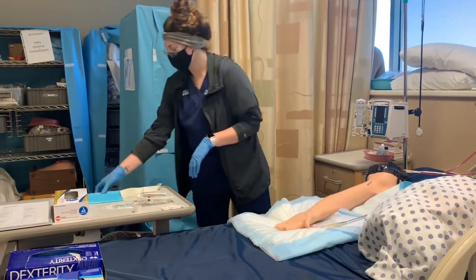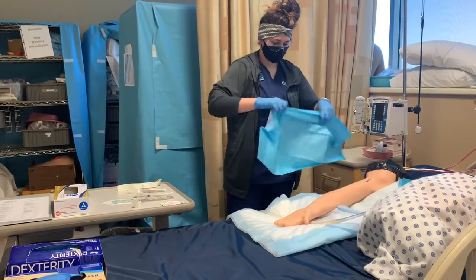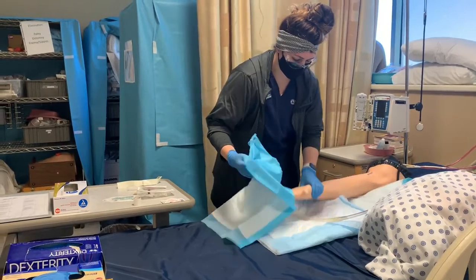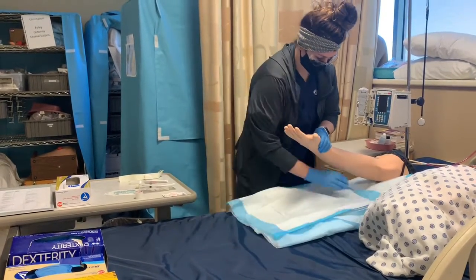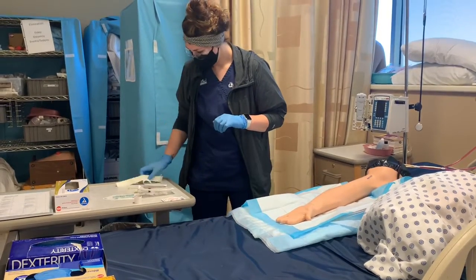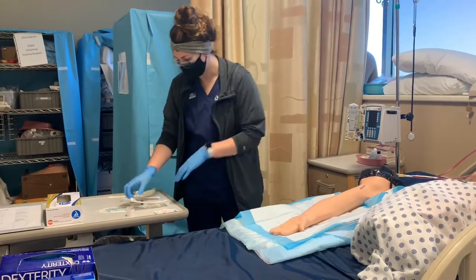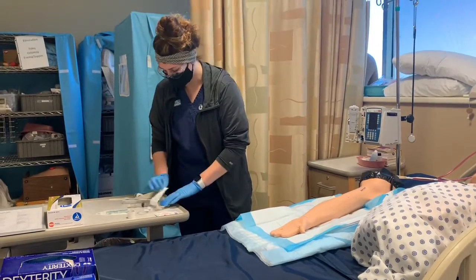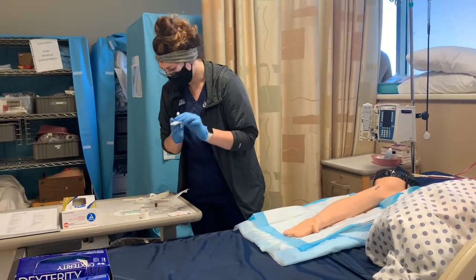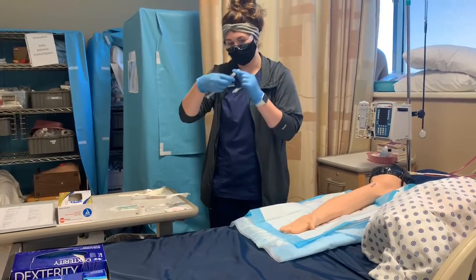Let me put, first, a pad underneath to protect from any spilling. You raise your arm. Thank you. Okay, perfect. So before I prep the site, I'm just going to grab my supplies and make sure I've got everything ready here. Wash my hands since I touched her skin. Got my extension tubing and my saline. She's not allergic and it has not expired.